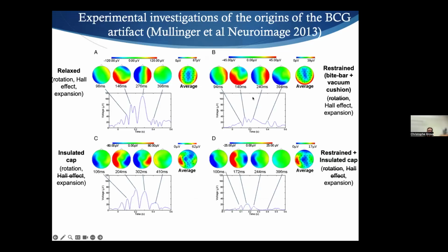And actually, what Karen did in that study, she tried different effects. And what she did is she recorded this ballistocardiogram. So basically each time she has a QRS, she's recording the EEG signal, and then you can average your different QRS and you get your response. So you see most of the artifact is coming here around 200 to 400 milliseconds. And this is when your subject is relaxed. So if we go from the 3 hypotheses, here you have all the 3 hypotheses together. So it's perhaps rotation of the head, Hall effect, or expansion.